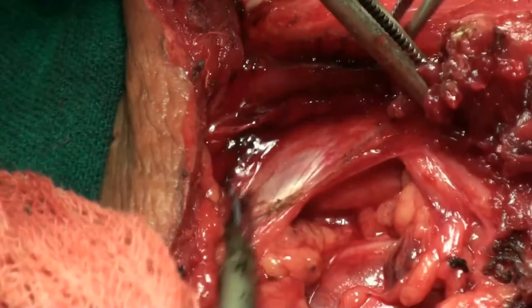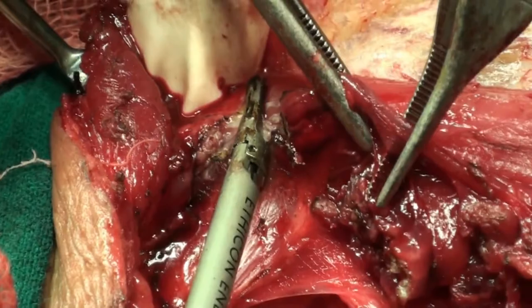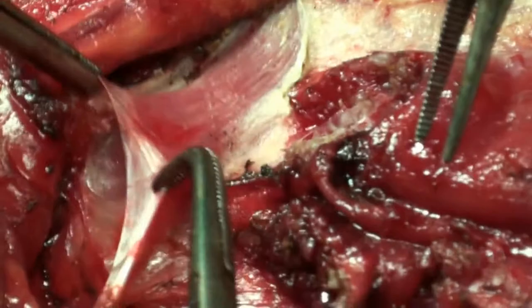Yeah, clearly now, that's omohyoid. Carotid sheath. Yes, sir. Jugular and carotid both. If you want to expose it, you can expose through this area. And I'm just going to feel for level 4 here. If there's no level 4, I don't do level 4 anymore.